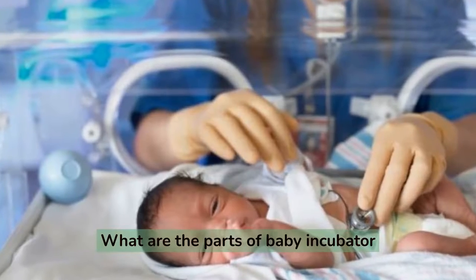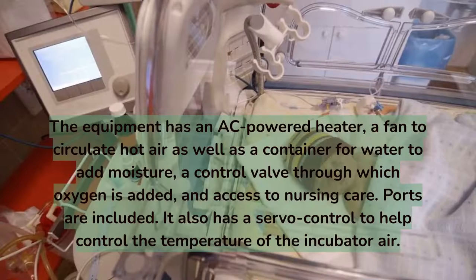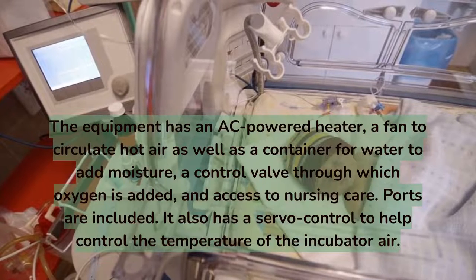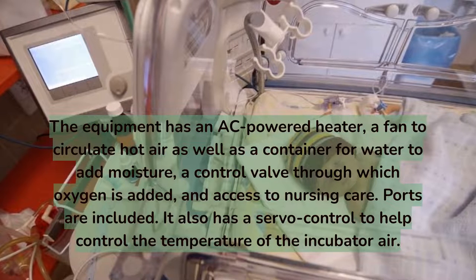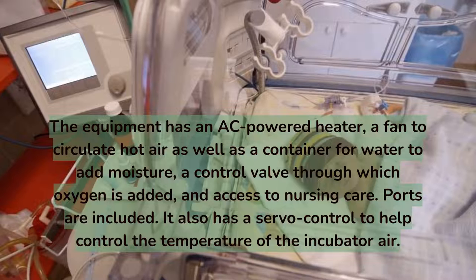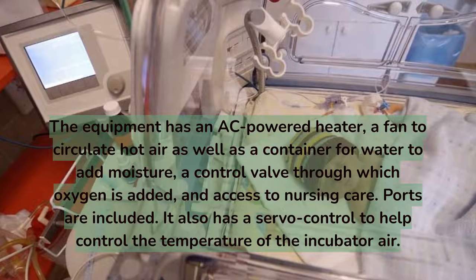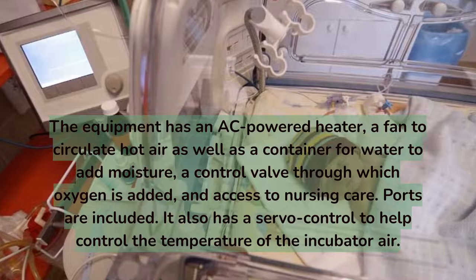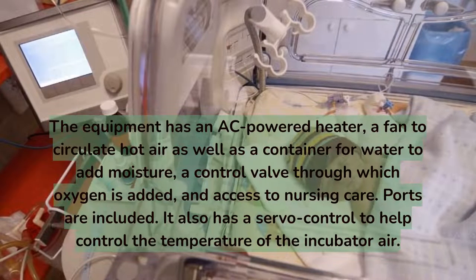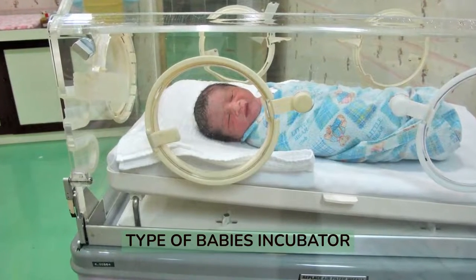What are the parts of a baby incubator? The equipment has an AC-powered heater, a fan to circulate hot air, a container for water to add moisture, a control valve through which oxygen is added, and ports for access to nursing care. It also has a servo control to help regulate the temperature of the incubator air.